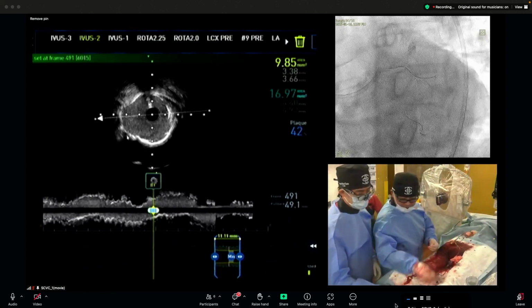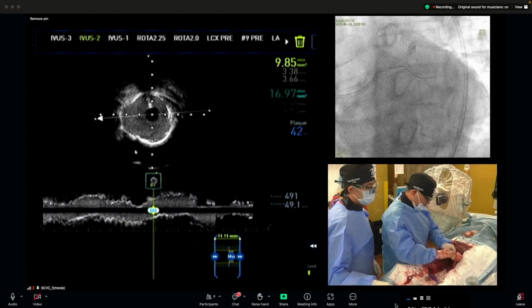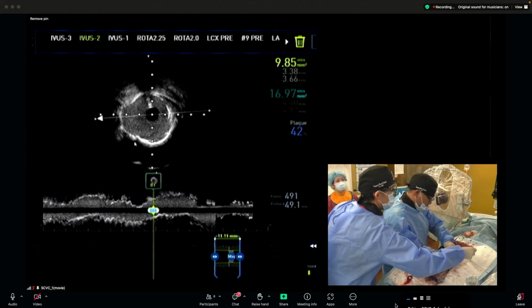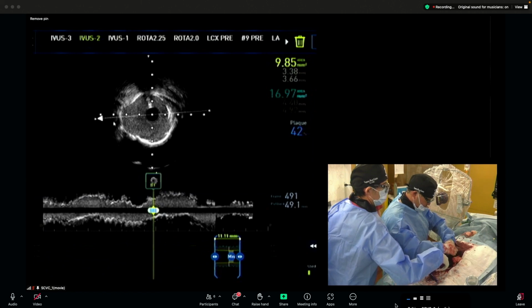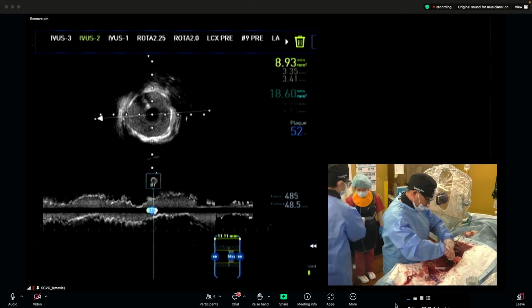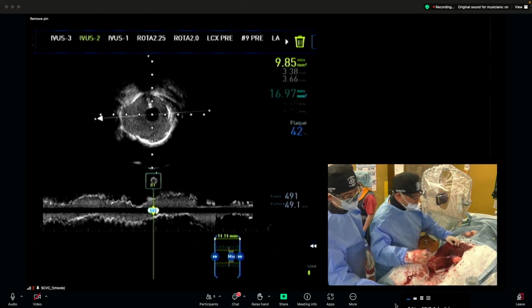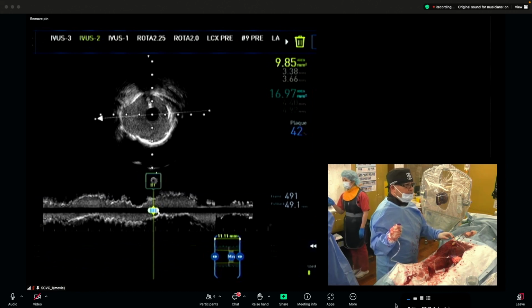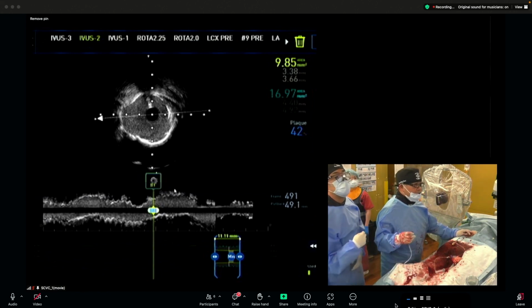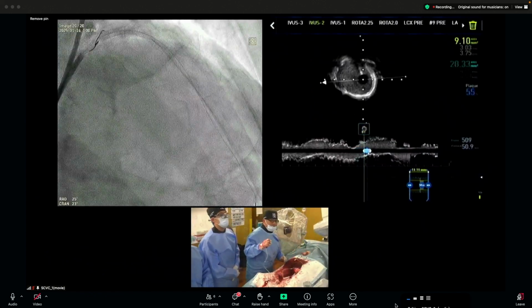So, Dr. Guan, can you see the IVUS? Yes, sure. Actually, I will show you your interesting point. And we can see the diagonal branch at the 9 o'clock. This is the diagonal. And this part looked like a very eccentric calcium at the beginning of the procedure. But looking at the stent expansion, it looks so nice. Right, yeah, very symmetric and circular.